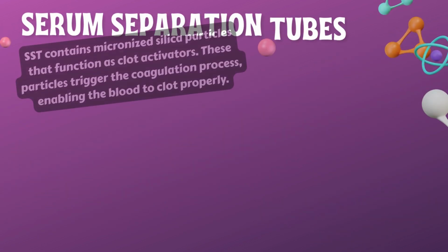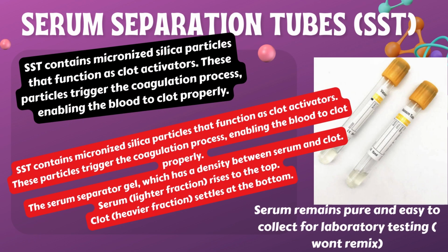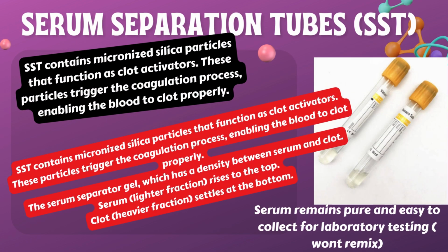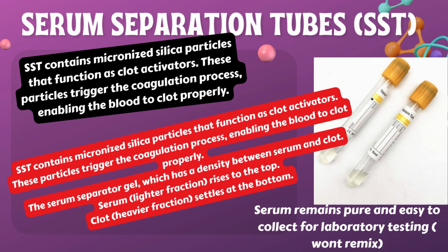SST contains micronized silica particles that function as clot activators. These particles trigger the coagulation process, enabling the blood to clot properly.